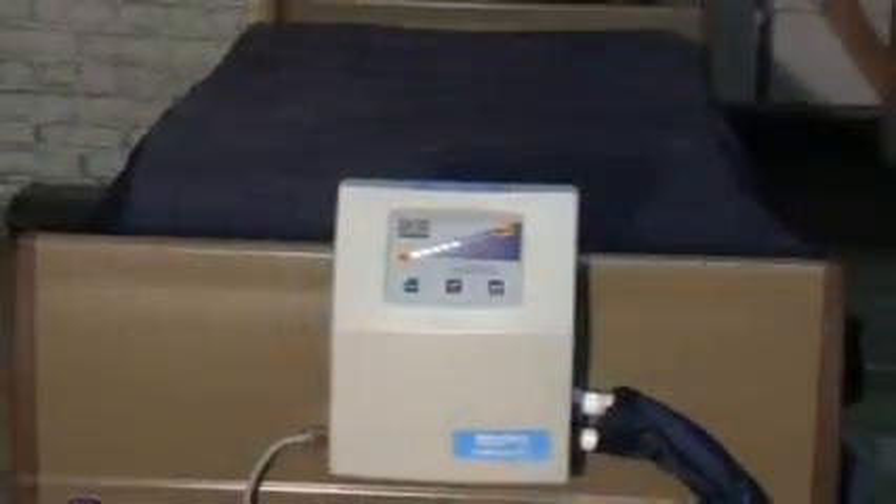Your Plexus 2500 low air loss therapy is low air loss and alternating pressure, 36 inches wide by 80 inches long, and it does have a weight capacity of 350 pounds.